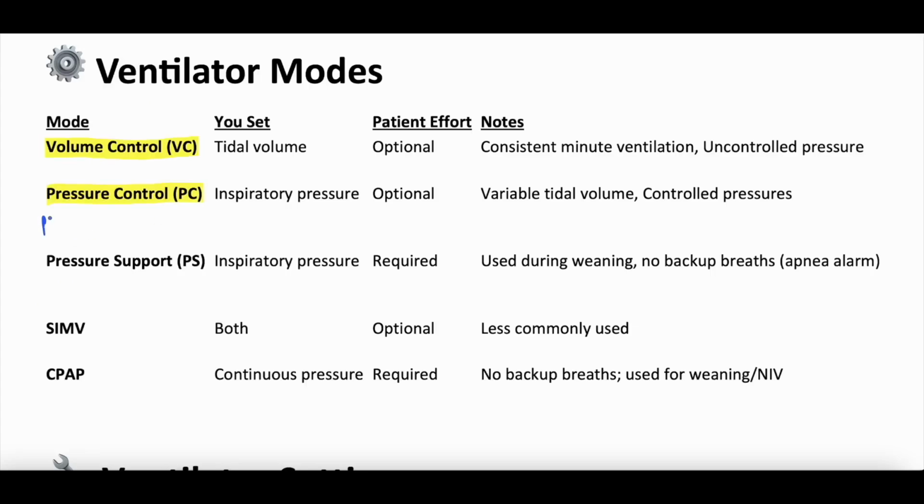Pressure control is more front and center in pediatrics, at least that's what we've been told. We don't work in pediatrics anymore. Whereas volume control is often our starting mode in adults. Now, there's certainly exceptions to this. There's some people in adults who still prefer pressure control. In our clinical practice, we tend to choose volume control first, but then sometimes we do end up putting the patient on pressure control for different reasons, and there's lots of complexity here. But just in generalities, for adults, we often start in volume control.